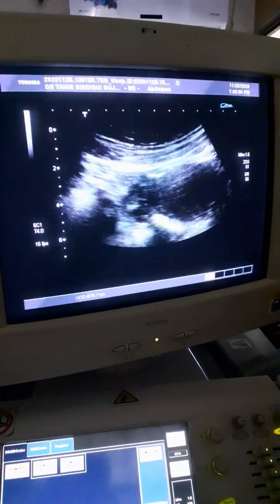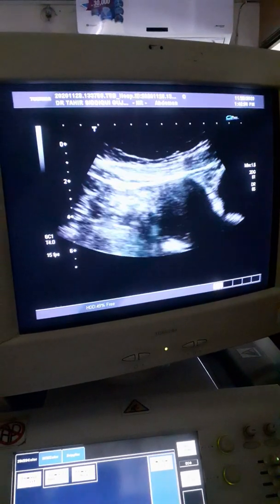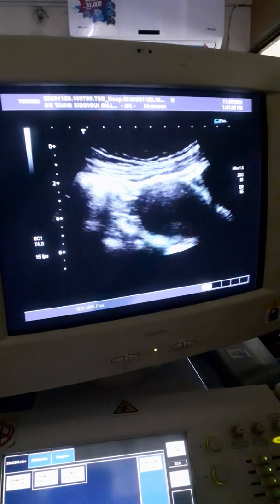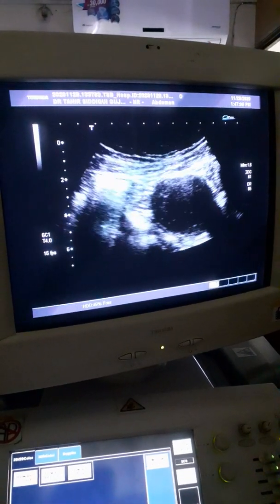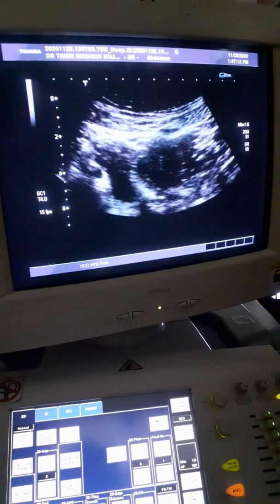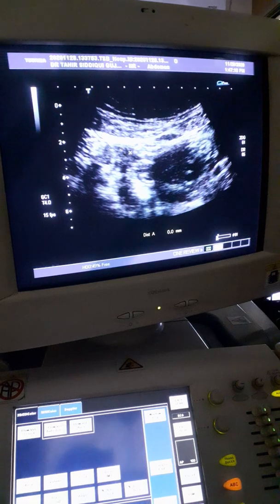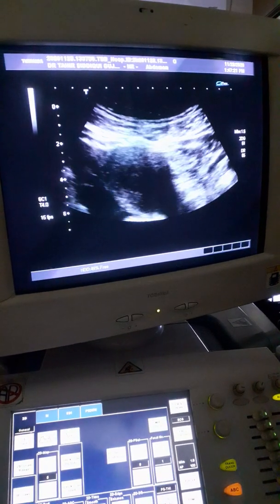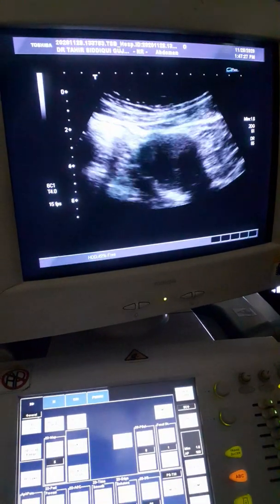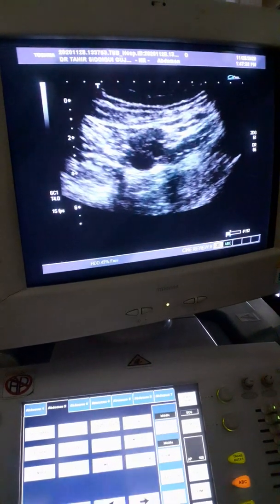This is the right ovary, showing you the follicular activity. And this is the left ovary, showing you follicular activity.